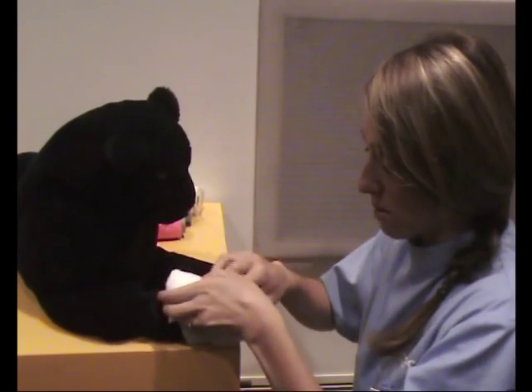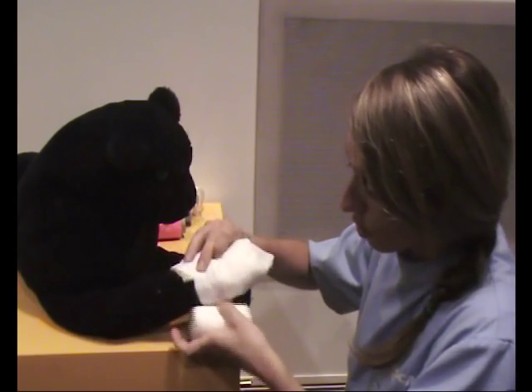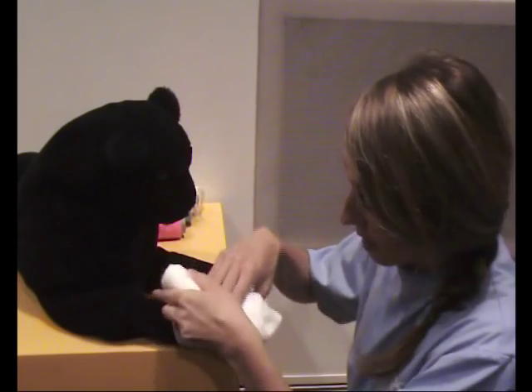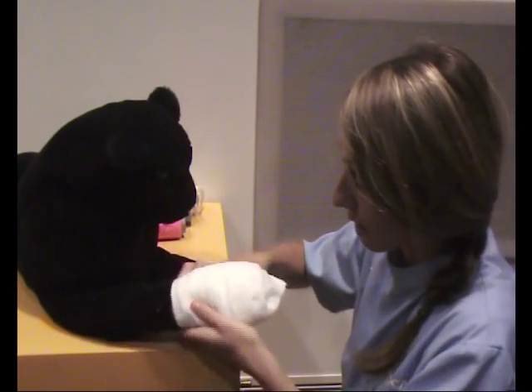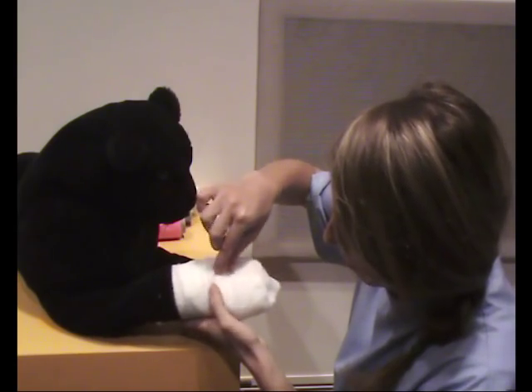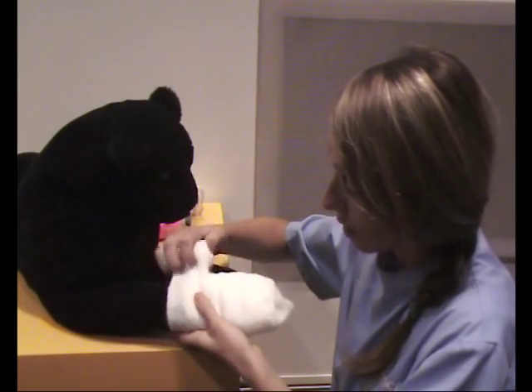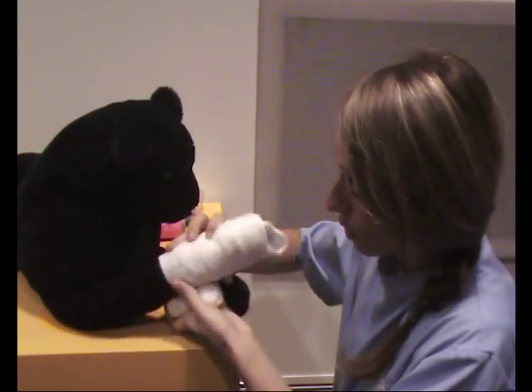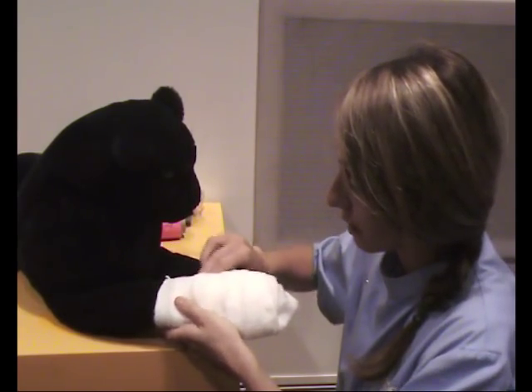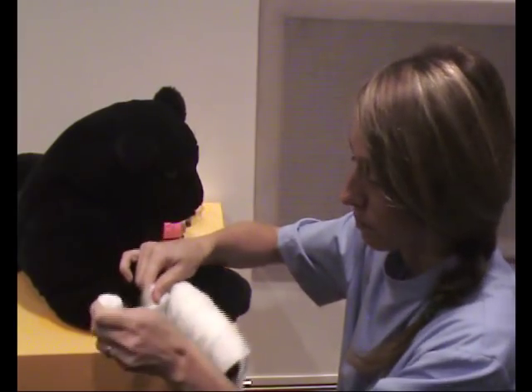Once we start going up the leg, it is good to overlap — that will prevent the bandage from slipping. About 50% overlap is fantastic if you can manage that. As we go up we want to entirely cover the Melolin; we don't want the Melolin sticking out. Continue up the leg and then you can rip the bandage off.